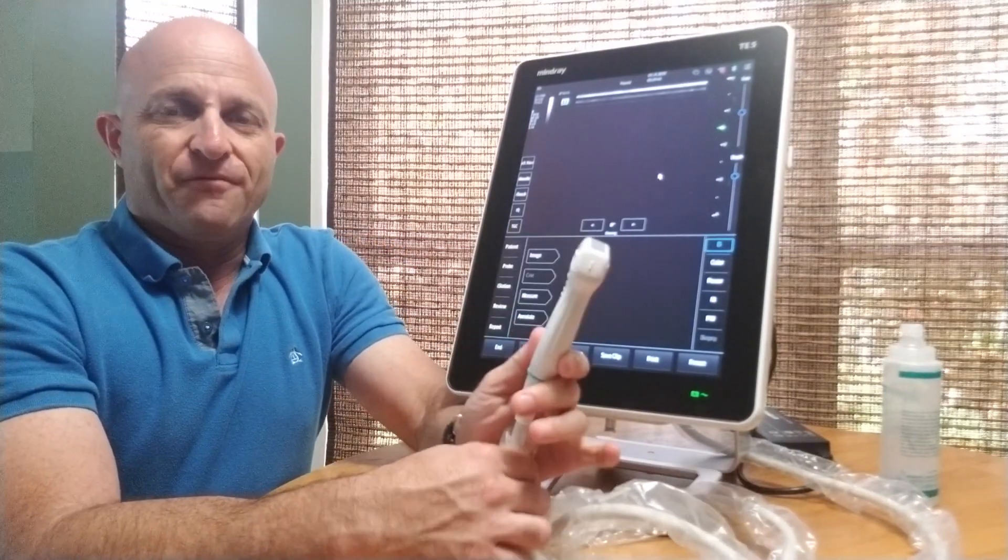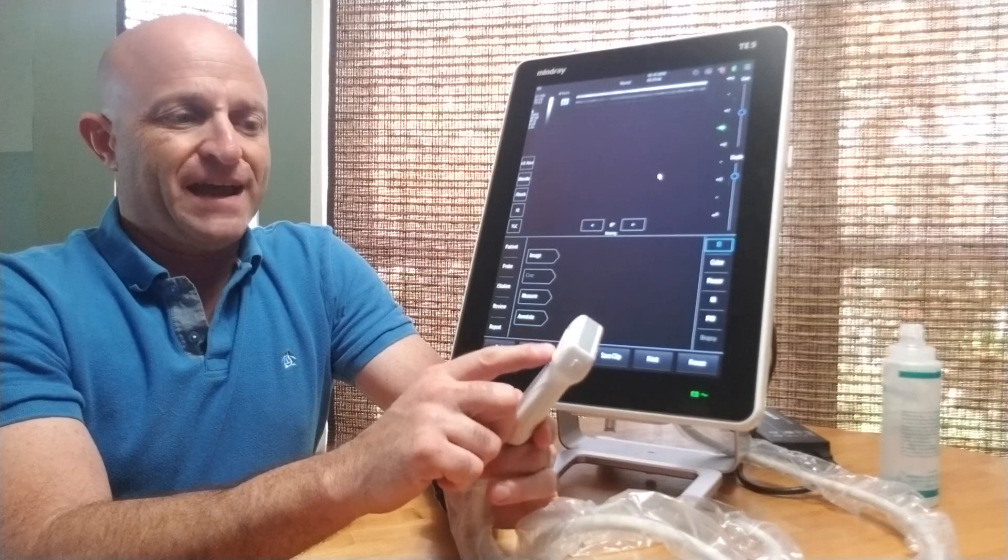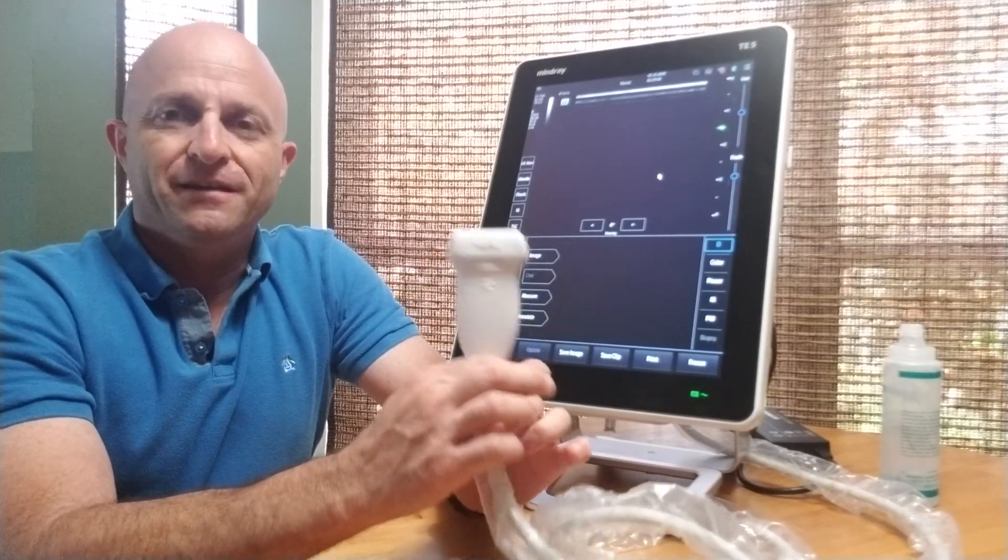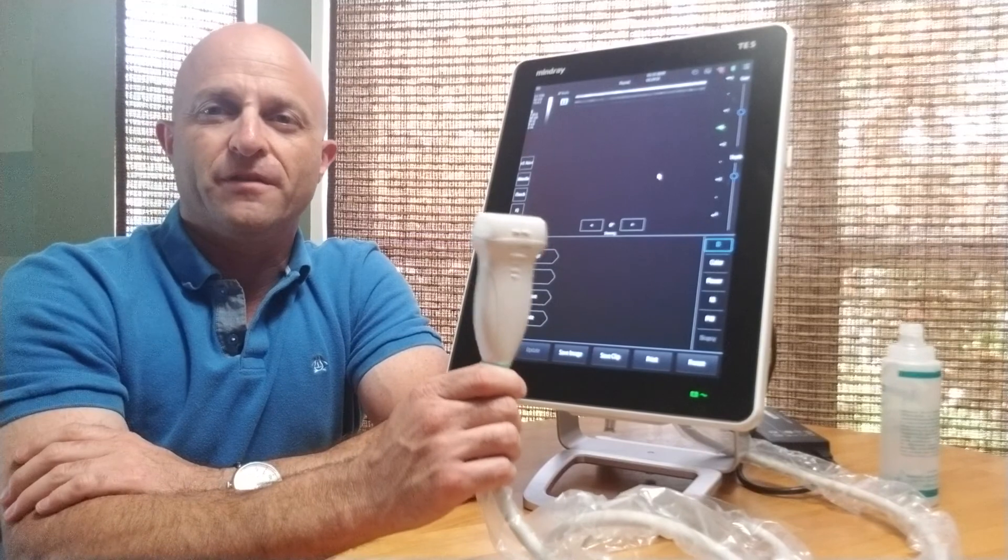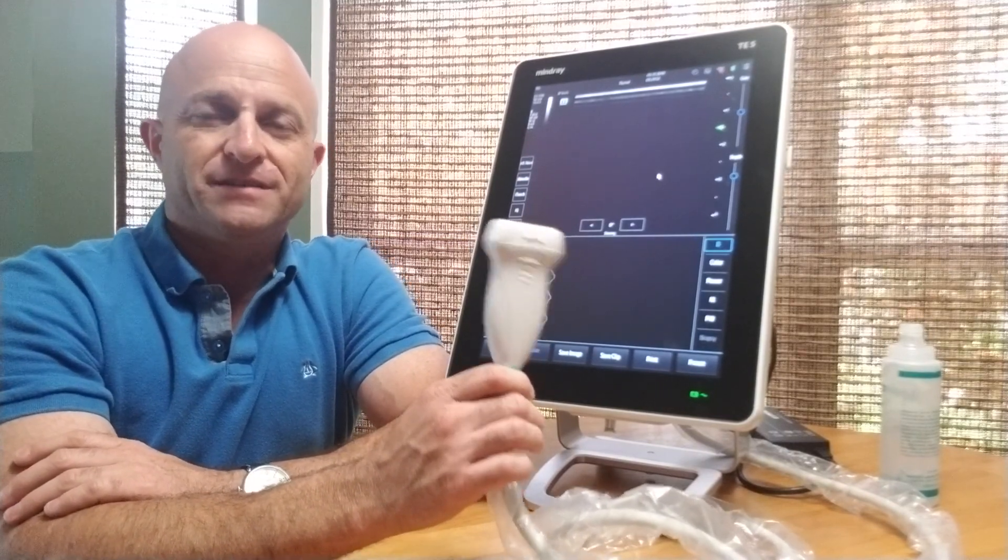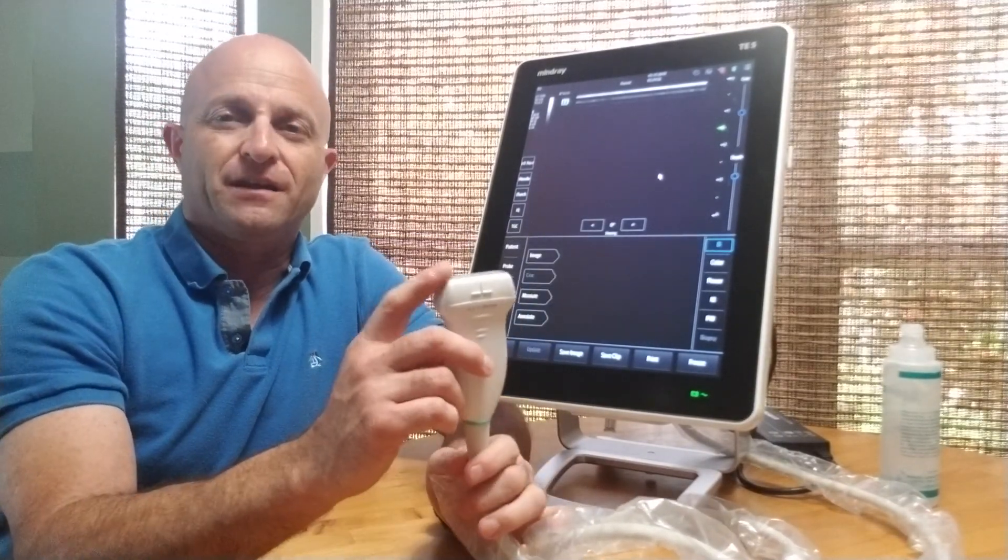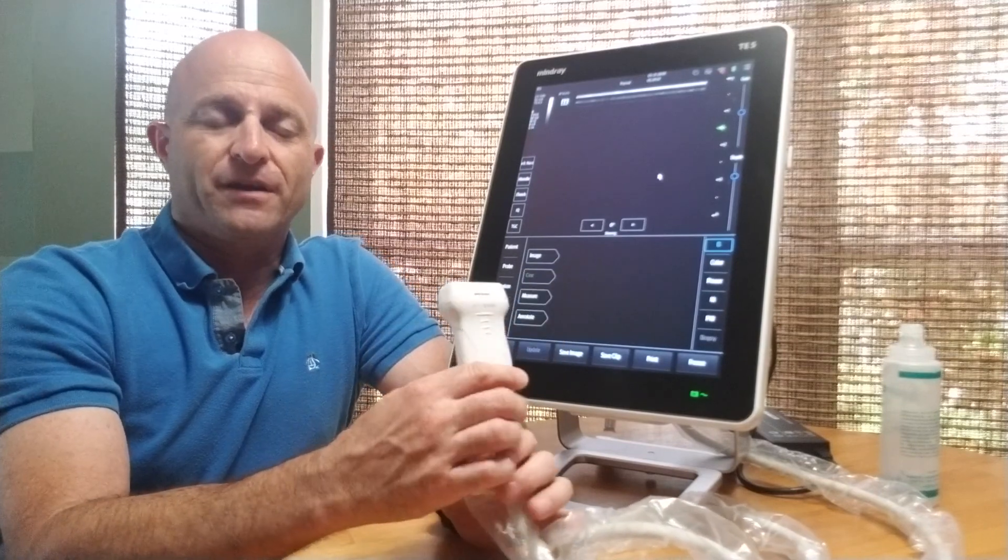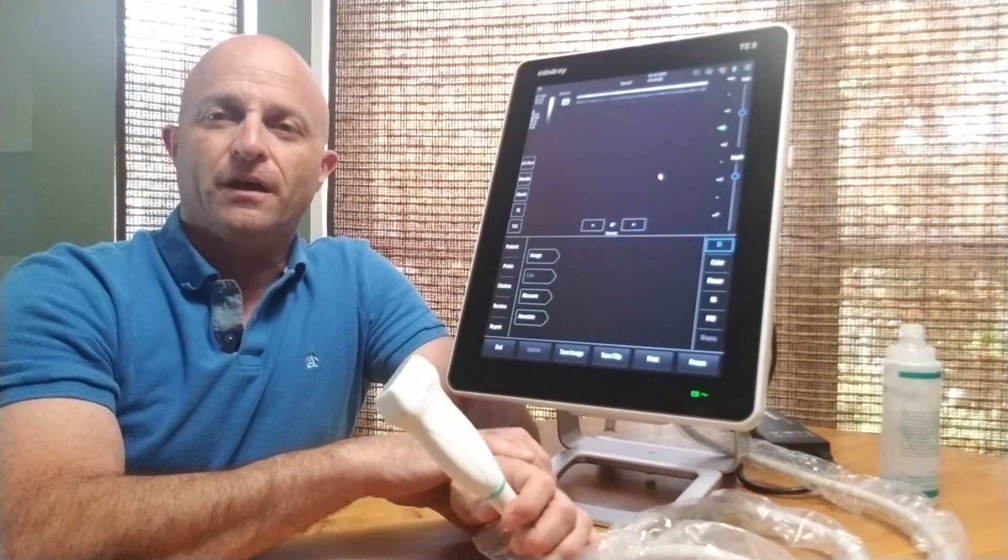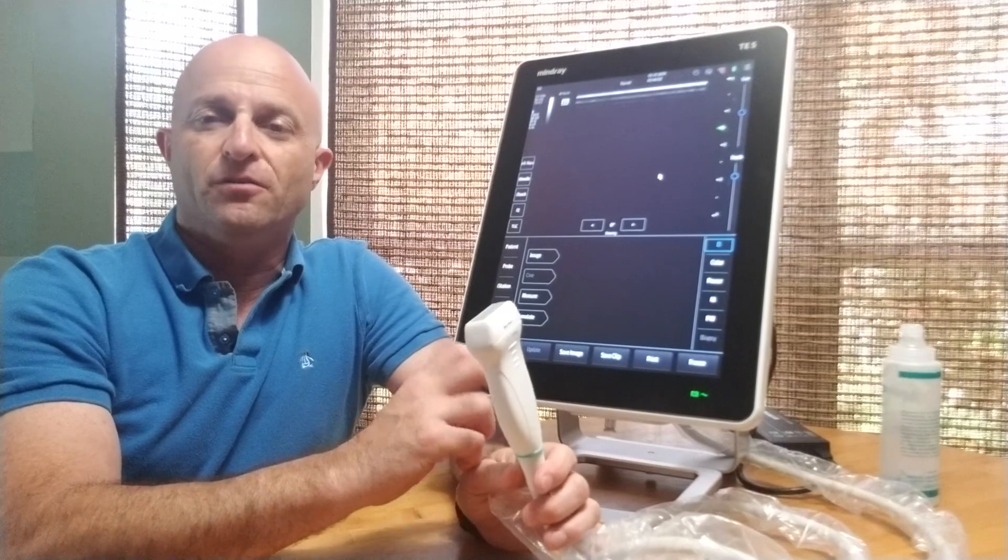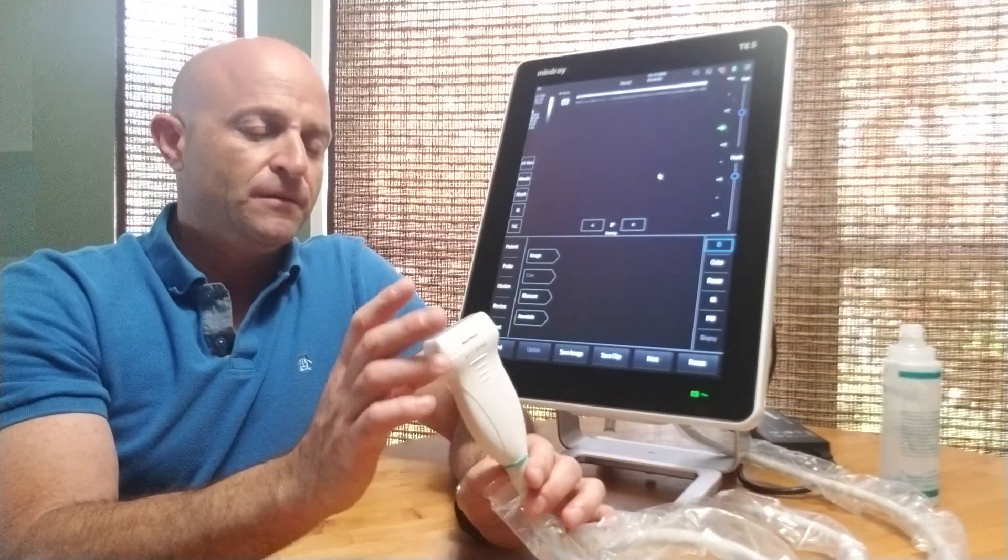The probe I have right now is the L11-3VNS, which works with the magnetic needle finding technology. With this technology, it doesn't matter if you're in a deeper structure where your visibility and view of a typical needle might be more difficult.